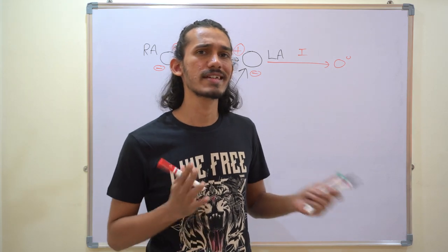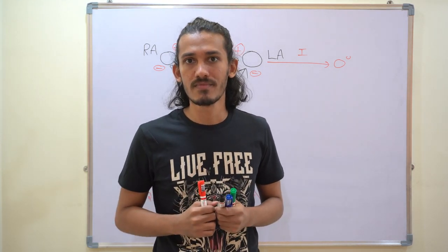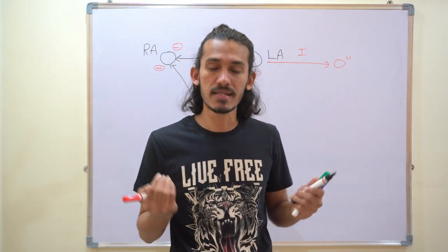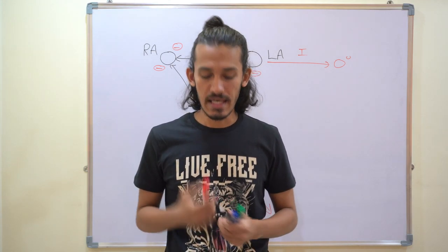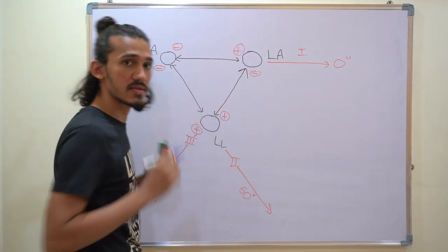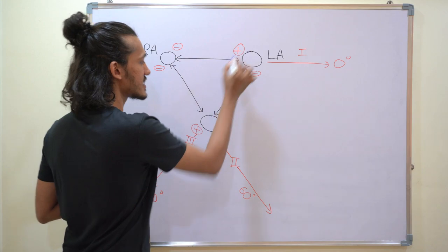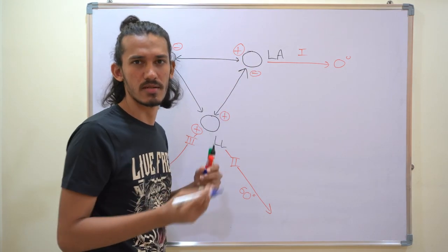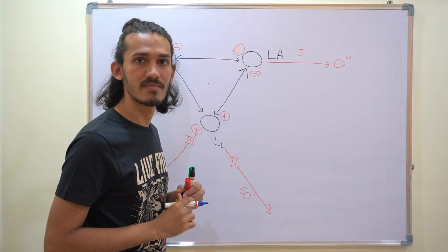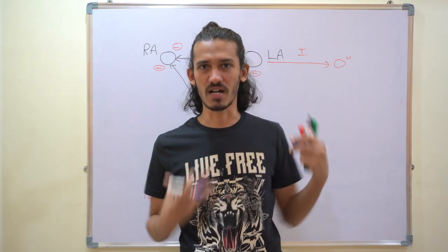So how are you going to create this near-zero potential in the inactive terminal? That is what Wilson had done. He created Wilson's central terminal initially. He put all these electrodes and connected them to each other, and created a central point in the Einthoven triangle. That would pretty much denote the center of the heart.